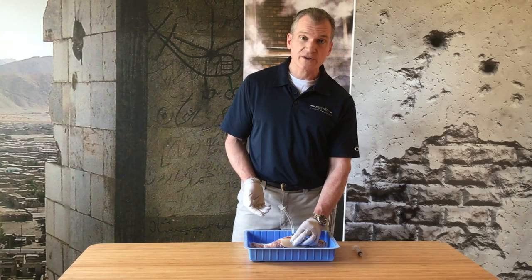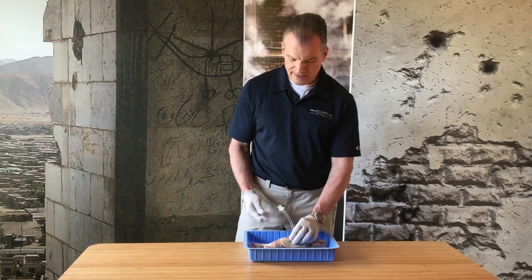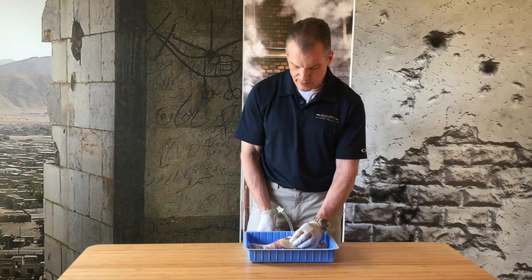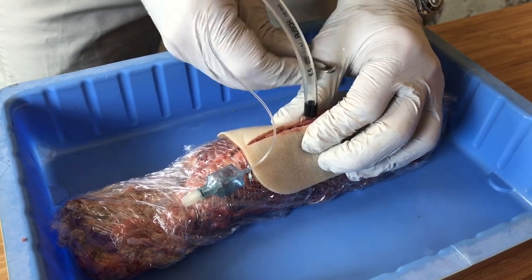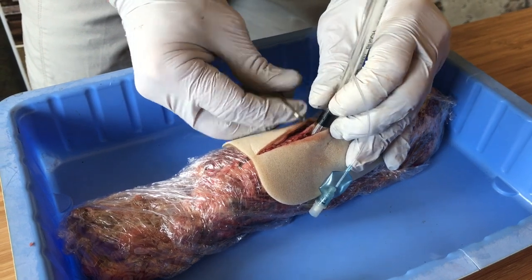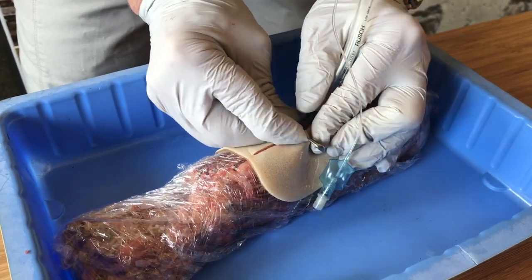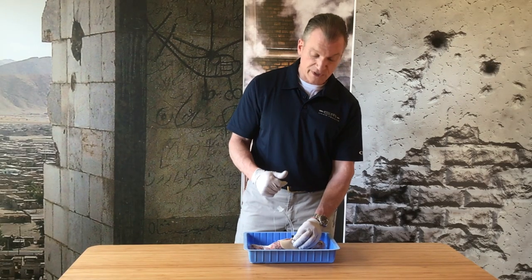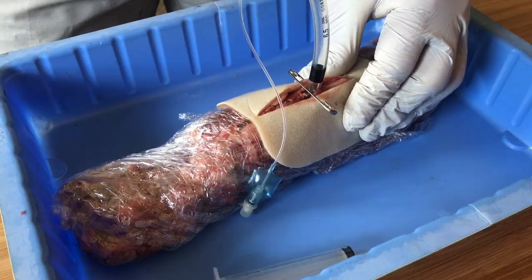At this point we've placed the cut-down endotracheal tube through the casualty's surgical airway or their cricothyroid membrane. He or she is now breathing through it. Our second-to-last step is to fill the pilot balloon or inflate the cuff. The final step is to secure this tube in place. One technique used by medics in the Ranger Regiment is to use these large military safety pins that come out of the military cravats as a securing device — you go through the skin and the cut-down endotracheal tube and just safety pin the whole thing in place, which is fairly robust. You're still better off using ties to secure this in place, but sometimes you have to co-opt the equipment at hand, and this is one technique that has been used in combat.